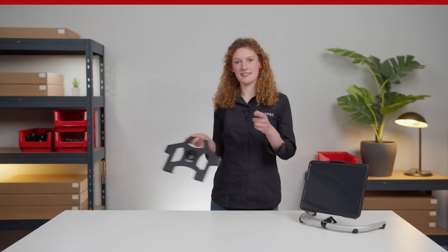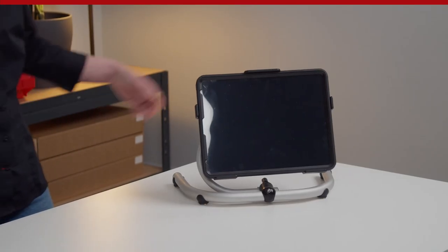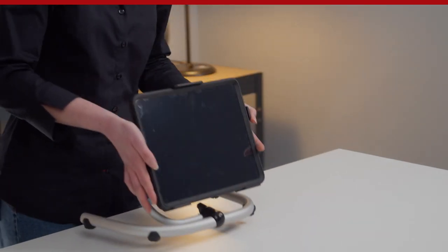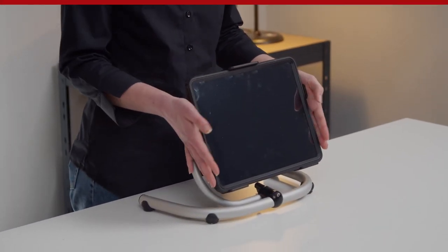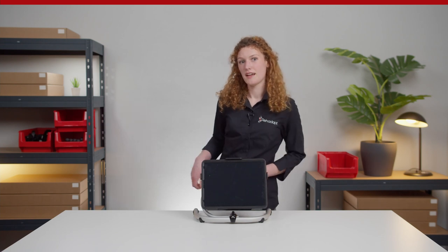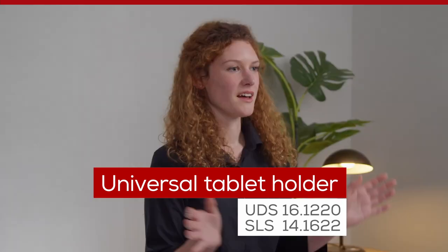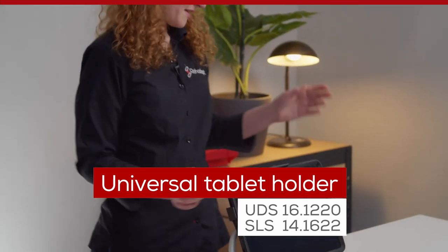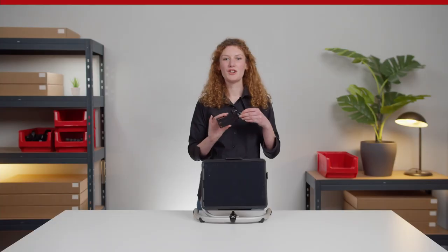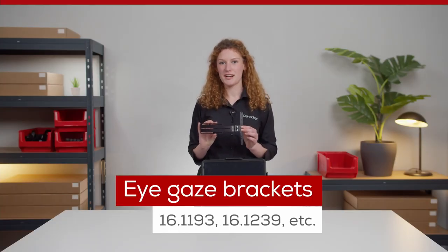These adapter plates are also available with our Spigot Link system as an alternative connection interface. The OB holders have a snug fit and only fit the matching OtterBox cases — other exotic cases will not fit and can be mounted using our universal tablet holder. These adapters can also be combined with the eye gaze brackets to attach the IB or HERO iPad and eye tracker to the tablet.